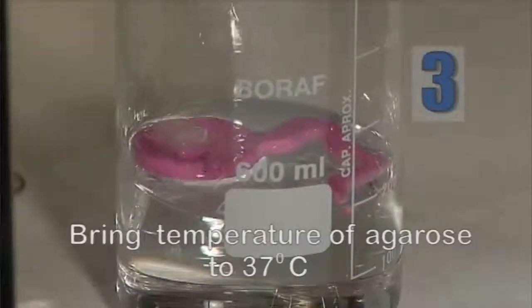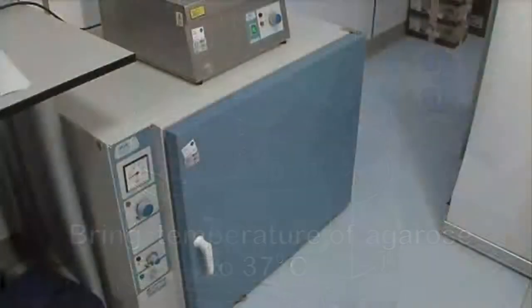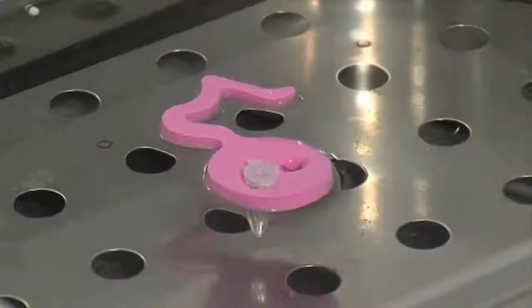Transfer the tubes to an incubator or water bath at 37 degrees centigrade for 5 minutes to avoid producing heat shock when introducing the sperm cells into the agarose matrix.